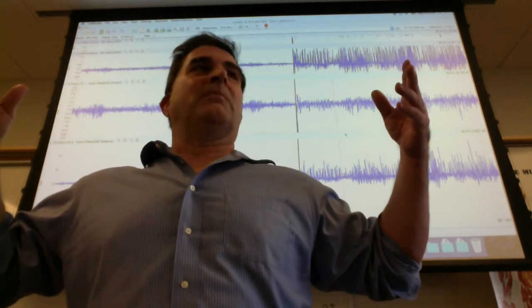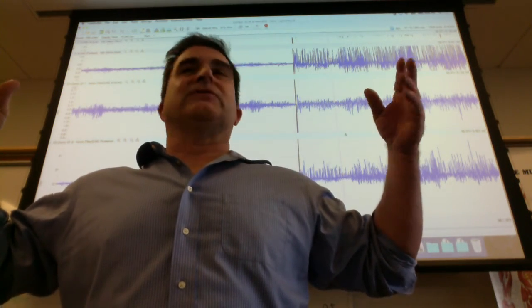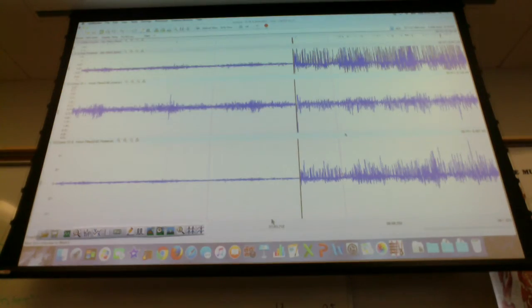You have to use more muscle. Muscle is made up of what type of cell? What are those things called? Muscle fibers, right? So I have to use more muscle fibers. The more weight I lift, the more muscle fibers I have to become active. And those muscle fibers are each depolarizing, right? And so as more and more of them depolarize, you get a bigger and bigger signal.